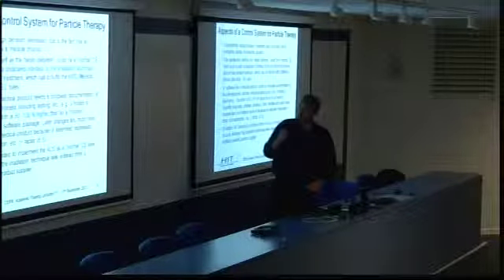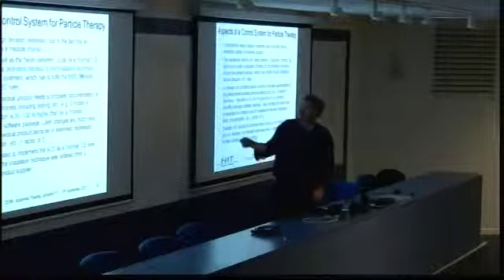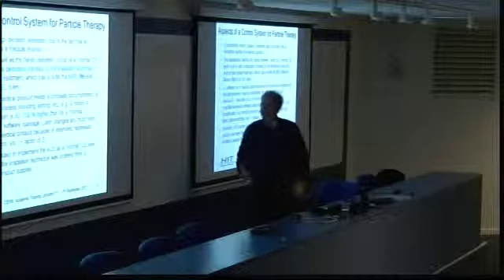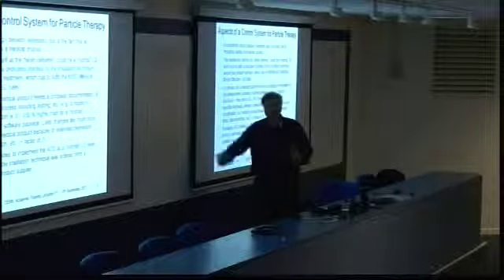Therefore, we make an interface between the normal machine, which we have to qualify and certify as an in-house product, as a more or less normal CE level product, and then a dedicated interface to the irradiation technique around the patient, which is a medical product.